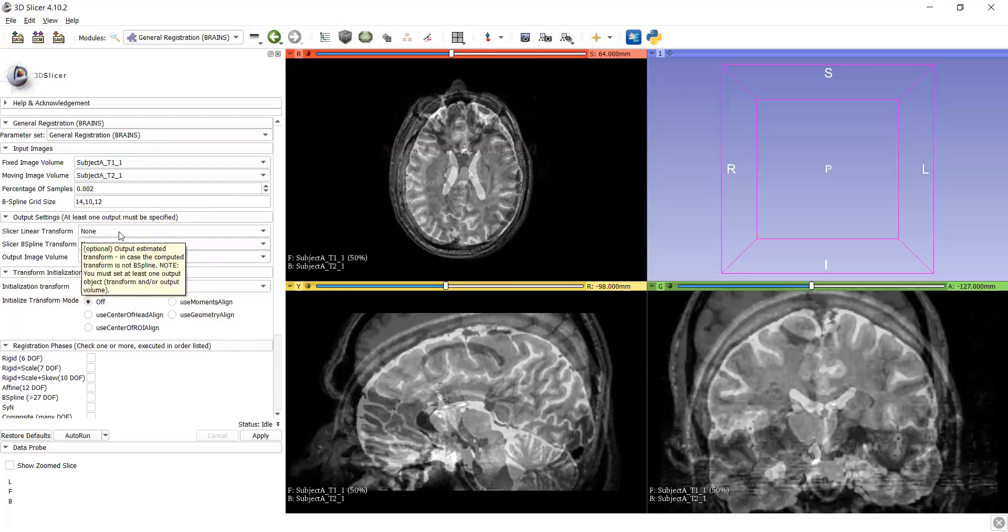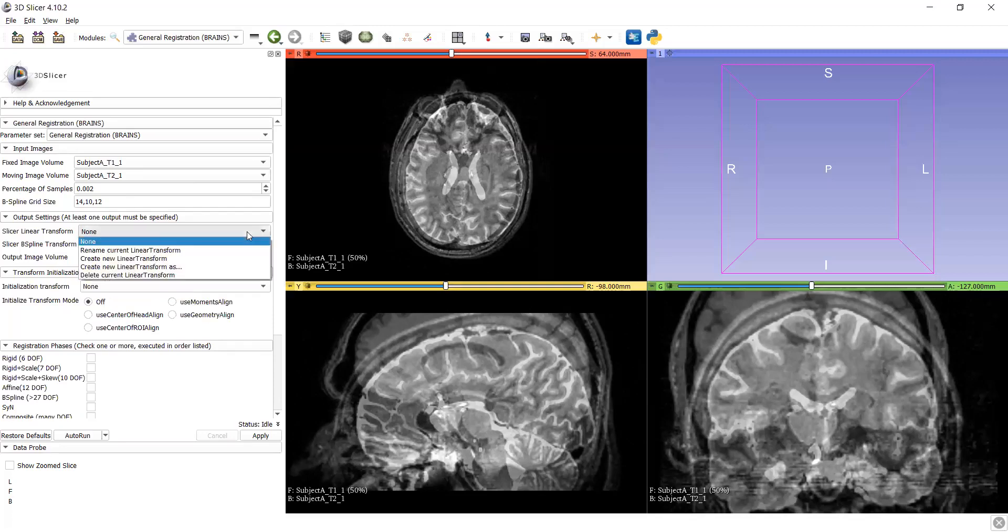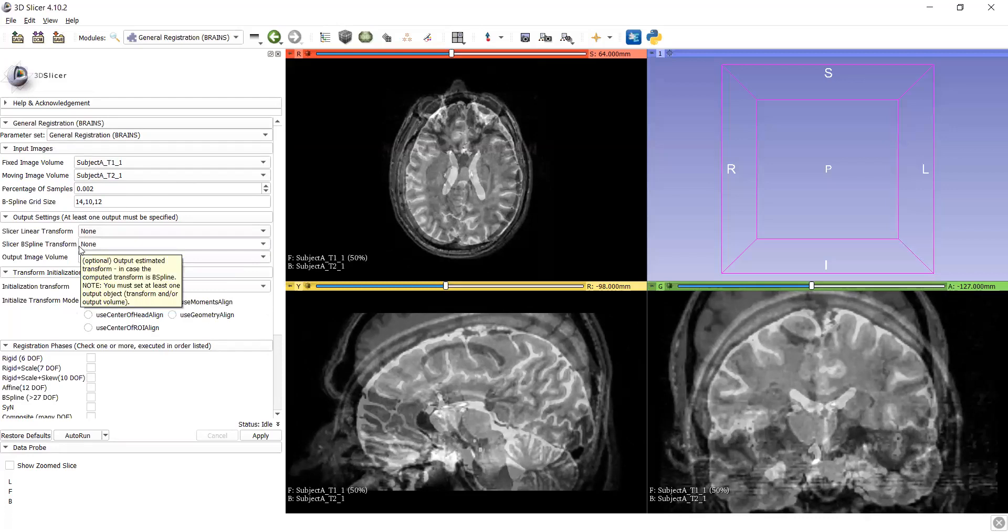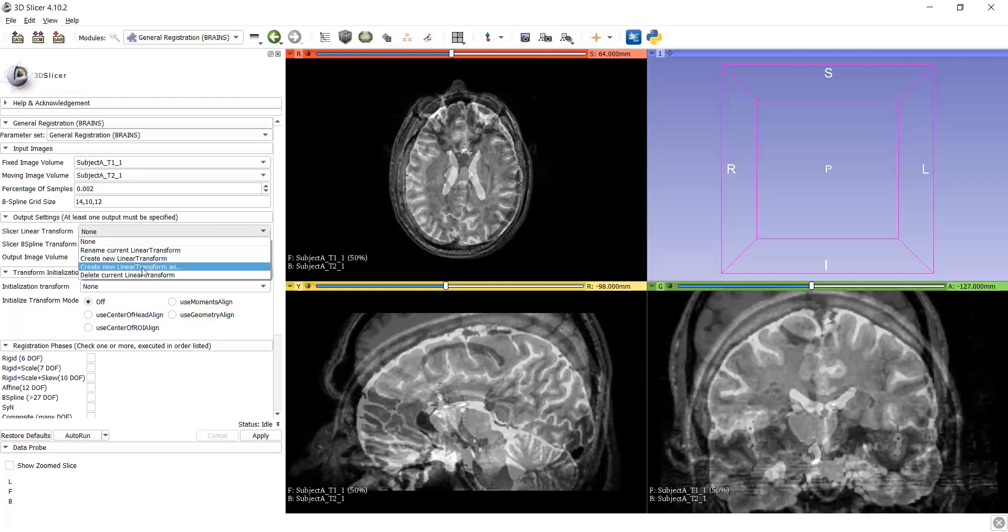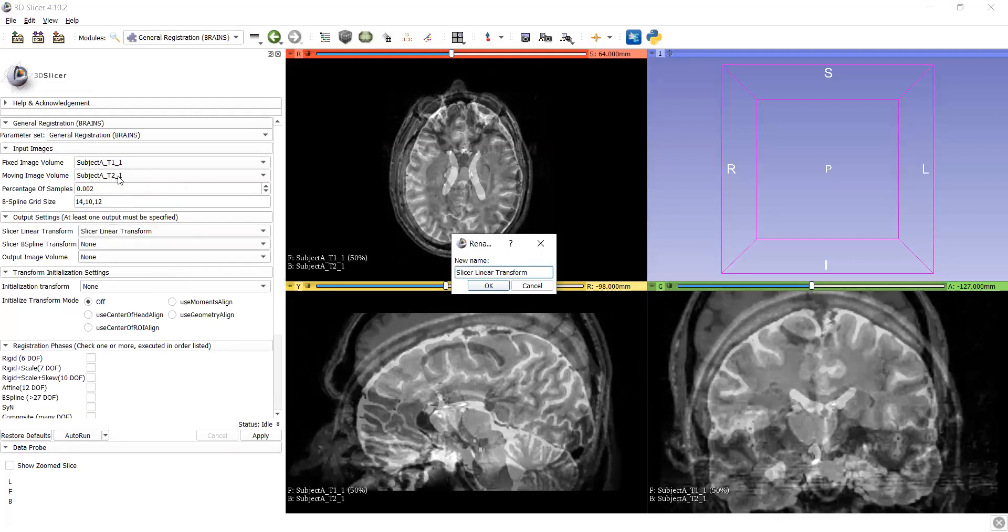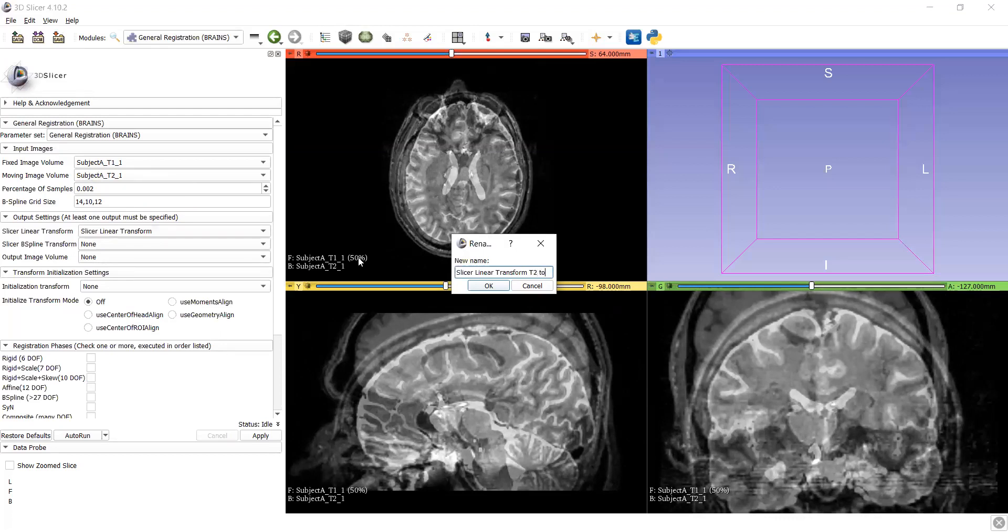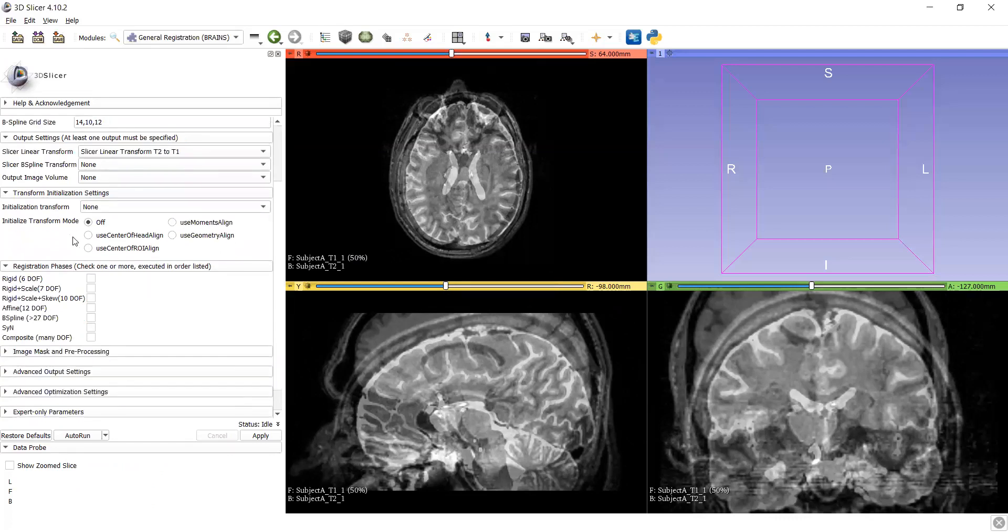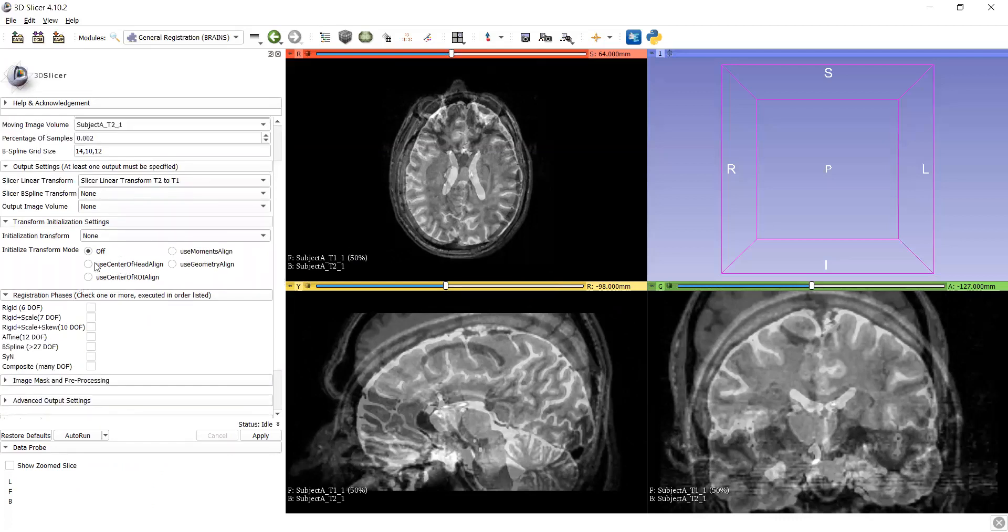We want to only linear transformation. This data can work in also in linear transformation, but as per data we can use the B-spline transform, other transform also. Let's choose the create new linear transform. Let's put name as, we want that here the fixed image is T1 and moving image T2. Means we are transforming T2 to T1. So put name likewise, T2 to T1.